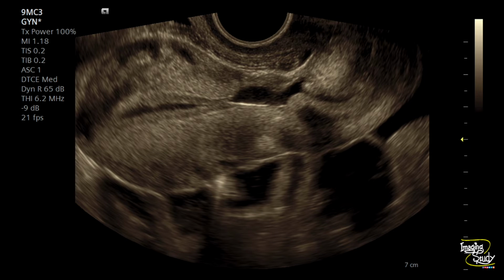And the picture of the cesarean section scar niche, the narrowing areas are here. As they act as a storage for the menstrual blood, it also acts as a source of dysfunctional uterine bleeding at 2 to 12 days after the routine menstrual cycle.